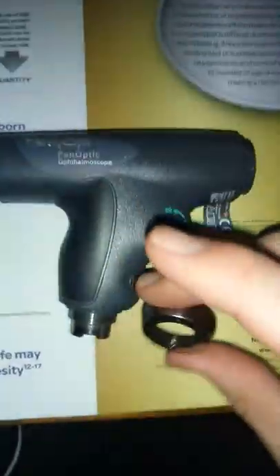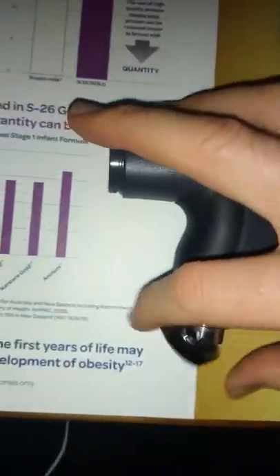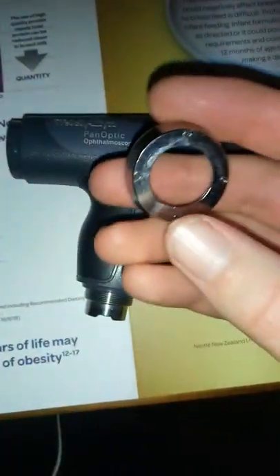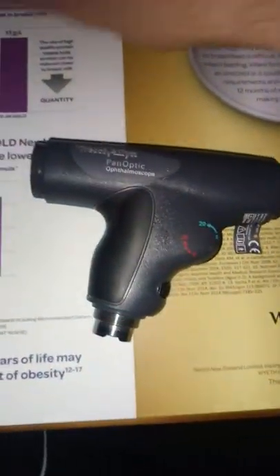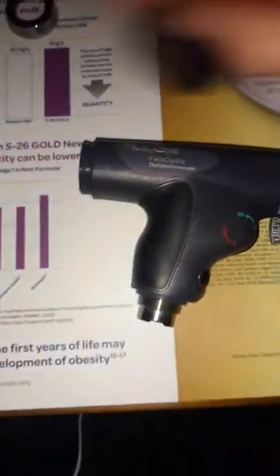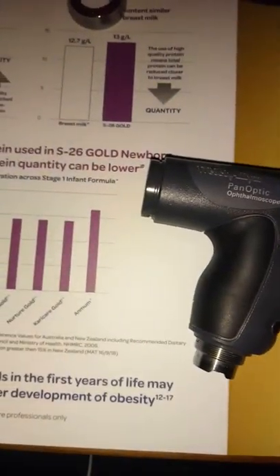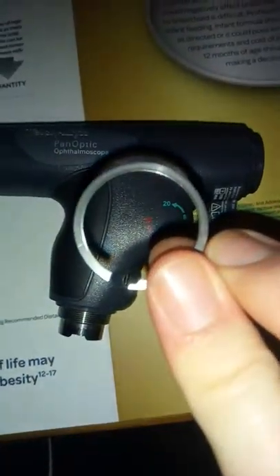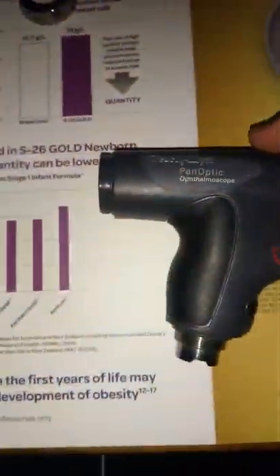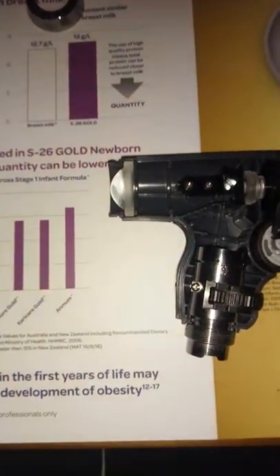So this little thing screwed off from here, from the bottom, so you have to use some pliers or something that can fit in these little holes to get it off, and the rubber stoppers on the ends just pop off, and there were these little split rings that you have to prise off the ends there. Okay, when you get it open, it just pops open, but like that.